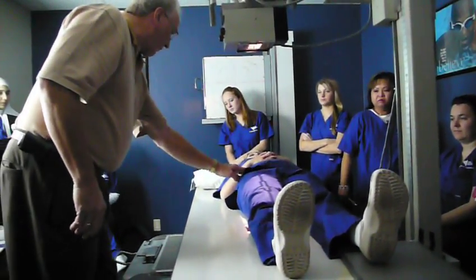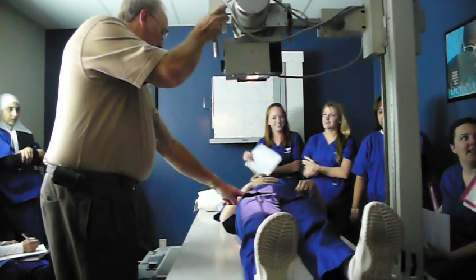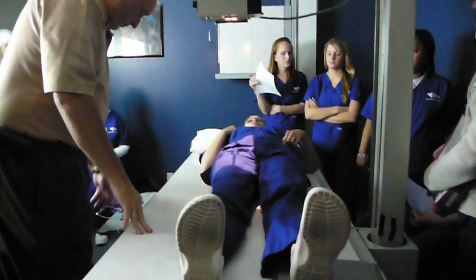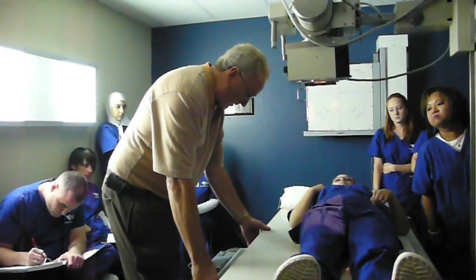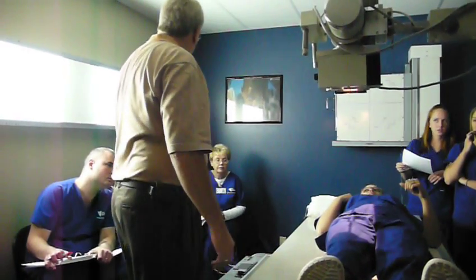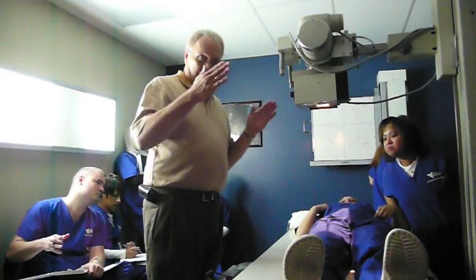Now if I do the proximal portion, I feel for ASIS. I put the top of my IR at ASIS — the top of the IR. So I have my light field here — I have a 17x17 already, so all you have to do is line my IR with it. There's my proximal femur, with the top of my IR at ASIS, for an AP of the proximal femur.